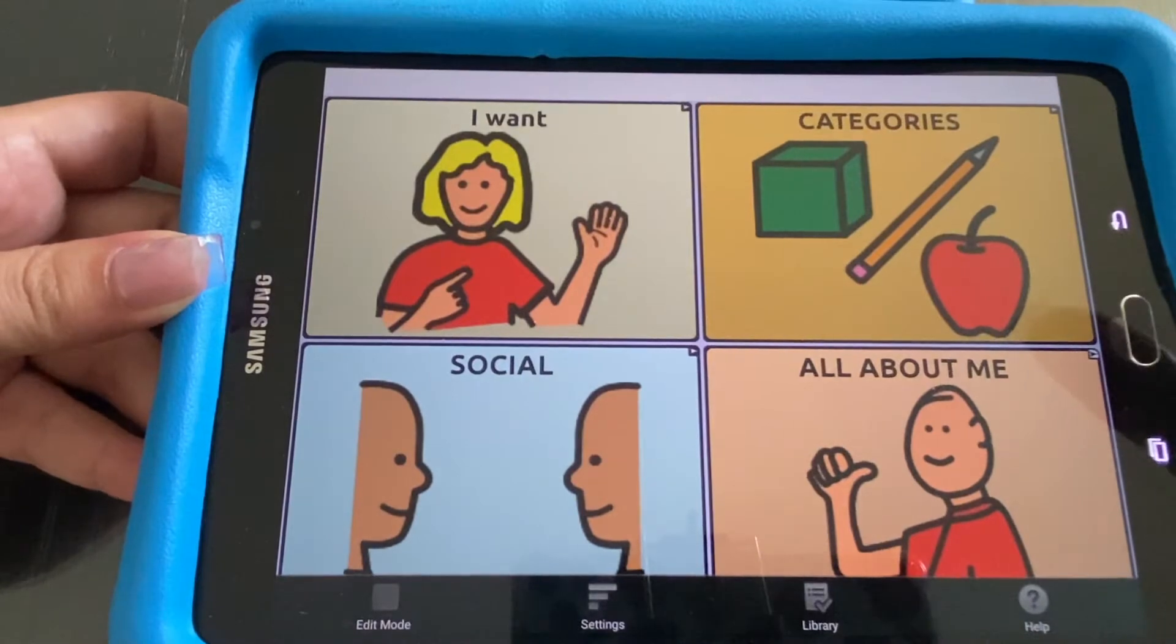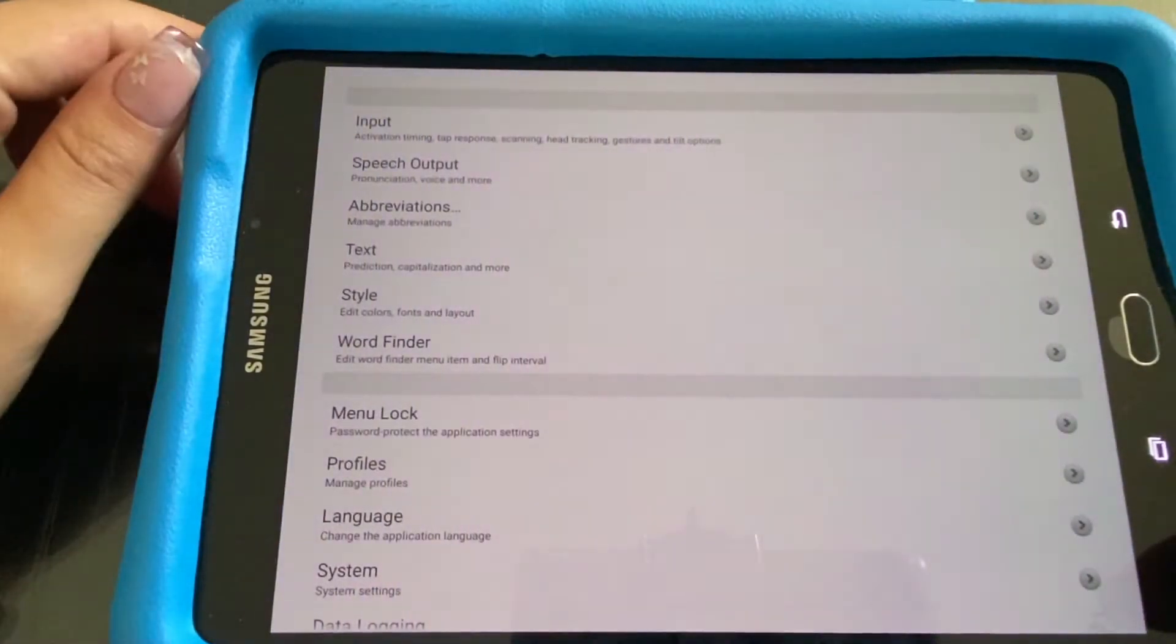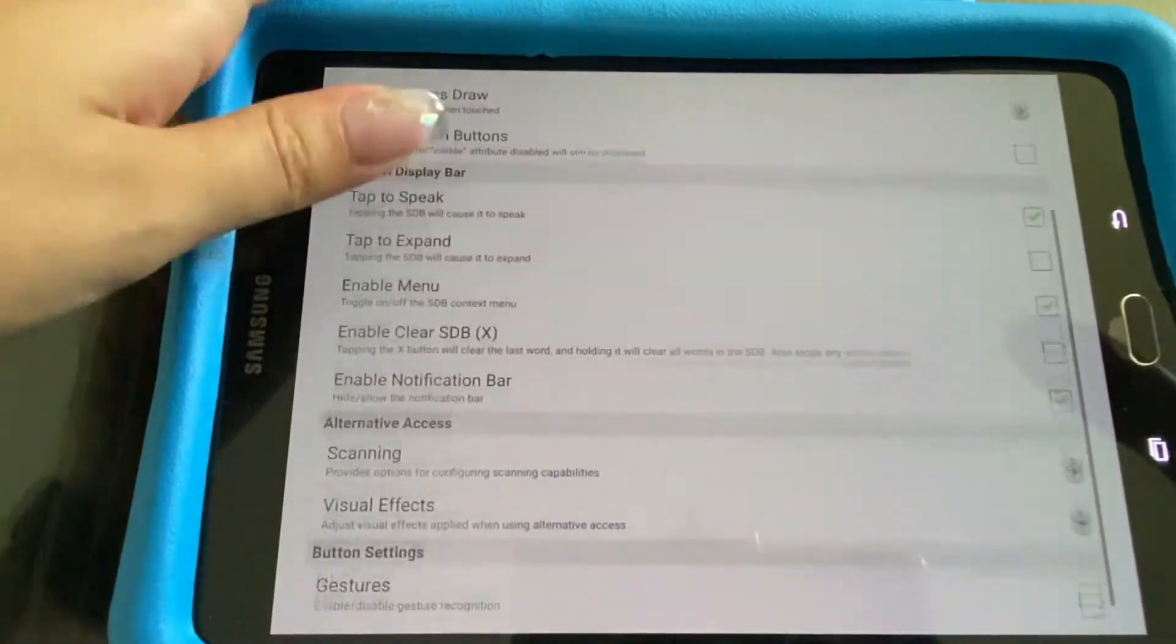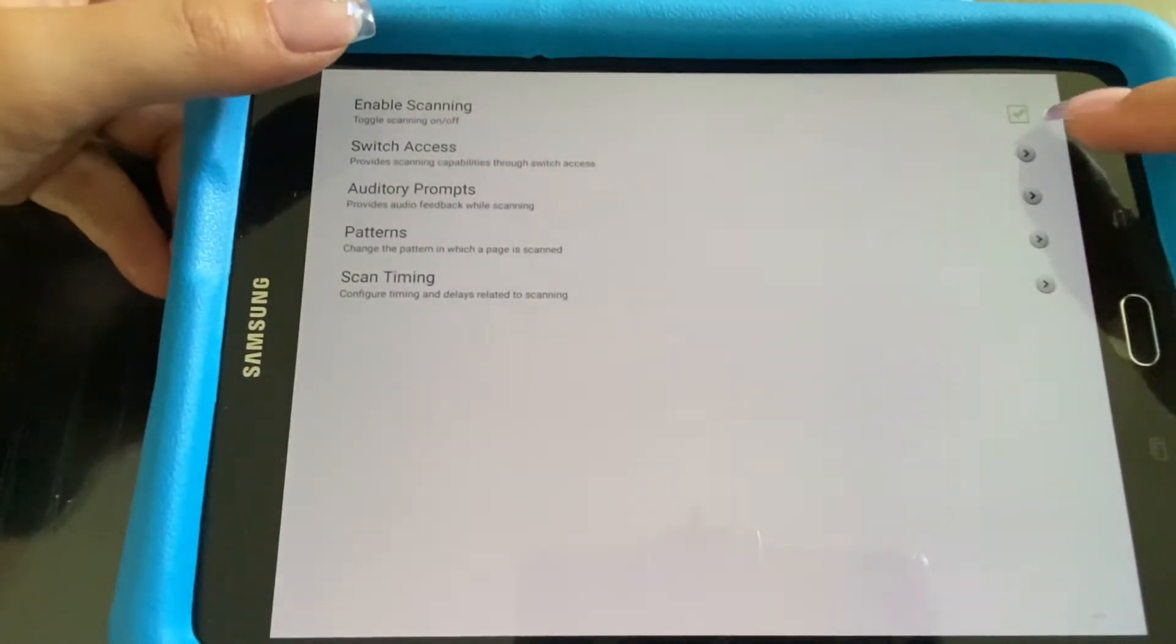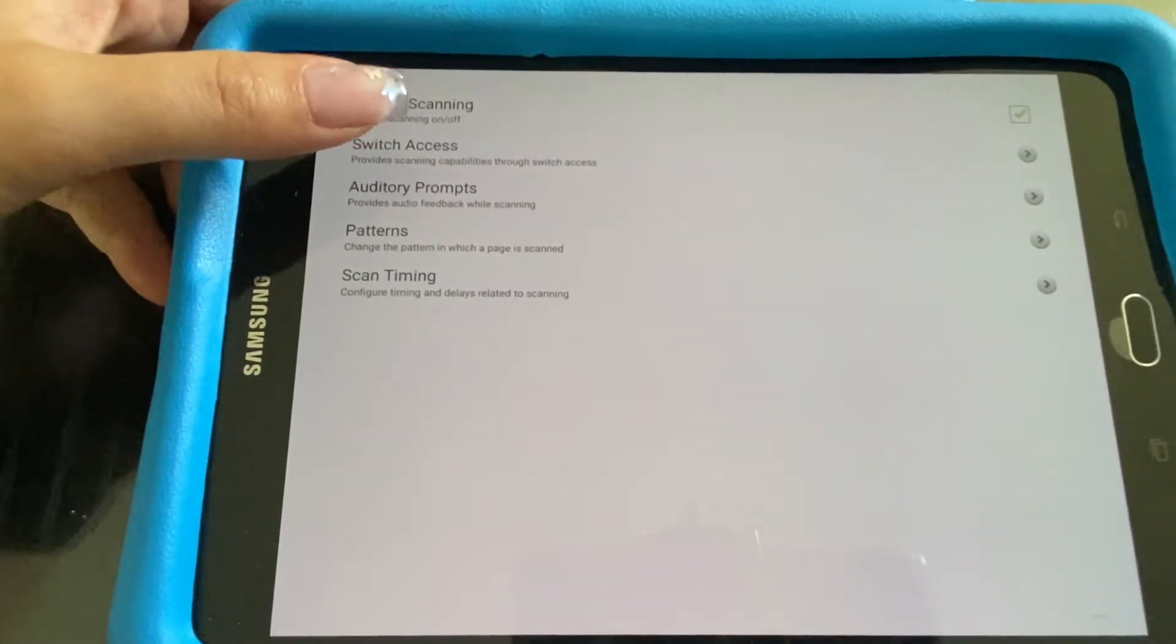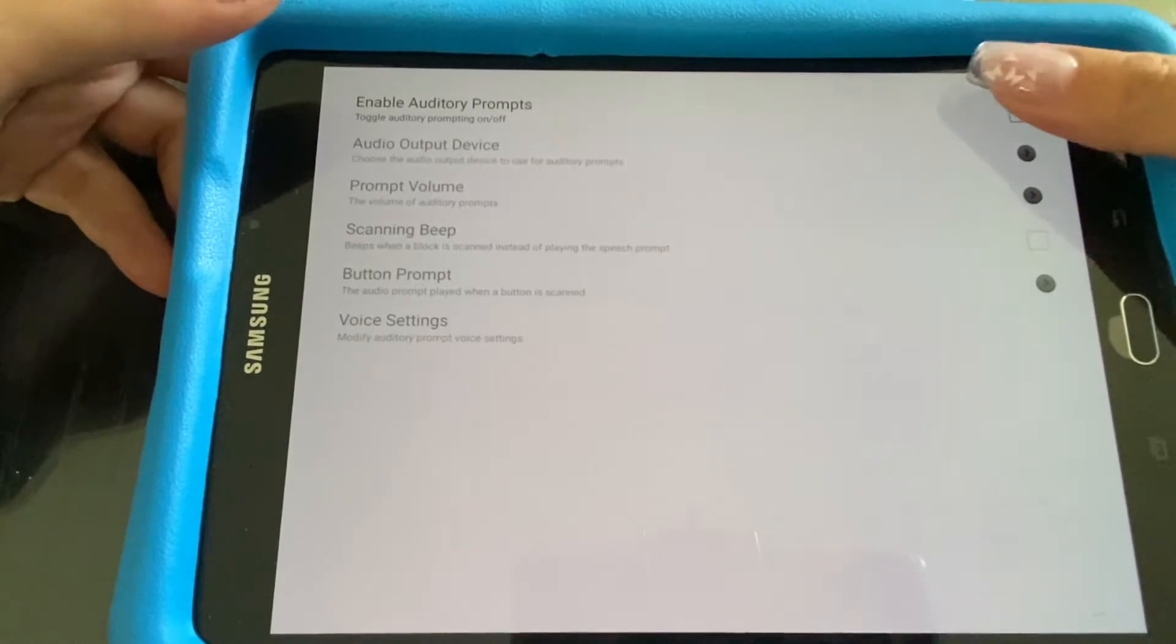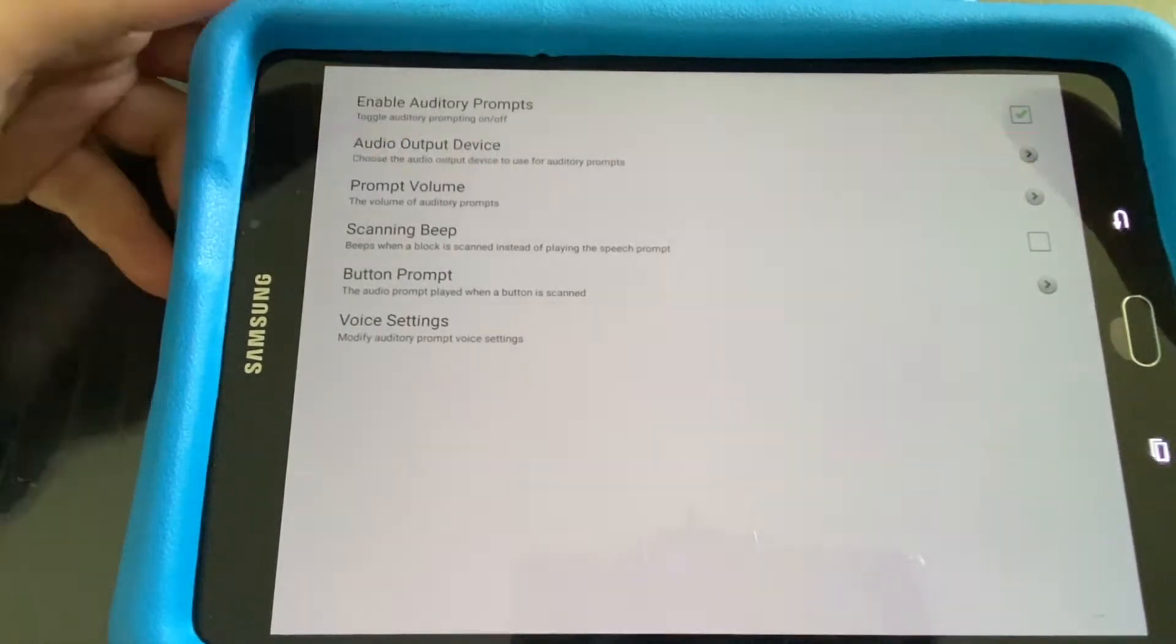You have to go into settings and go all the way down to where it says scanning. It's enabled now because it has a little check mark. Here you'll see the auditory prompts. You want to select the auditory prompt option and then you're going to look at the voice output.